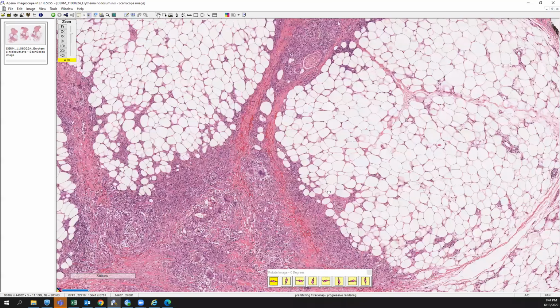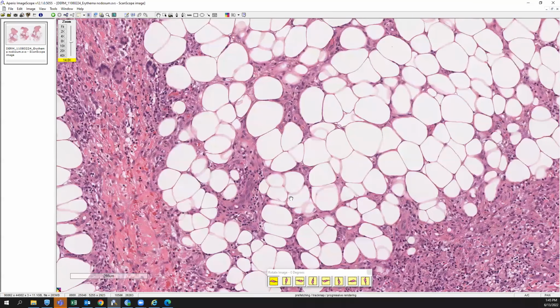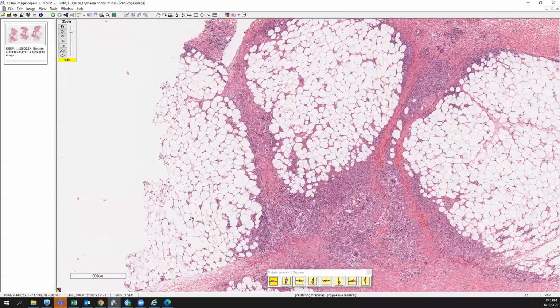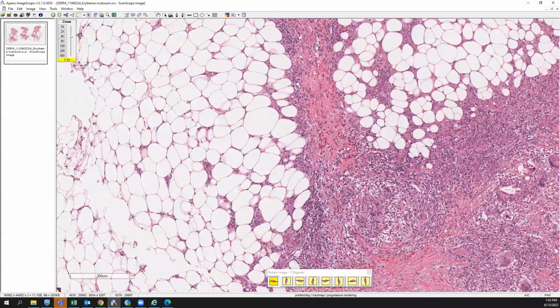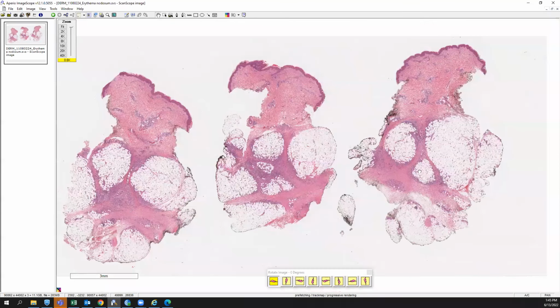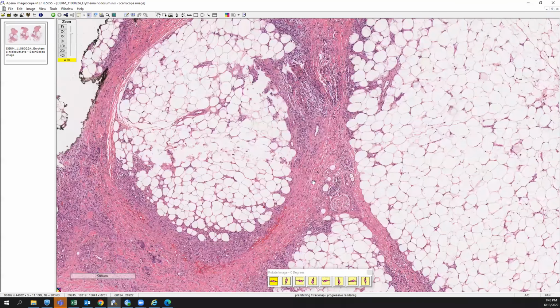Now, in reality, you do get some spillover into the periphery of the lobule. So if you just looked at this, you might think it's lobular, but you've got to look at it holistically, right? Most of the adipocytes have very clean wall-to-wall placement without significant amounts of inflammation. So this is a septal paniculitis, and your most key example of a septal paniculitis is erythema nodosum. So I just wanted to show you a really good textbook example of erythema nodosum.